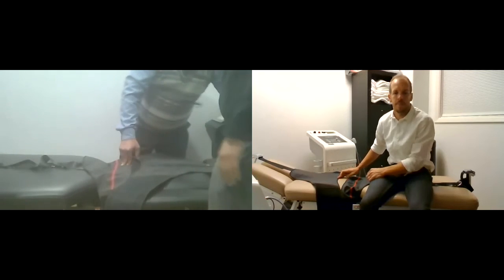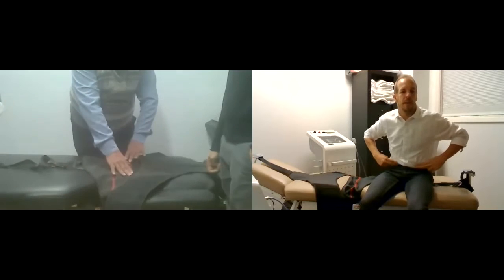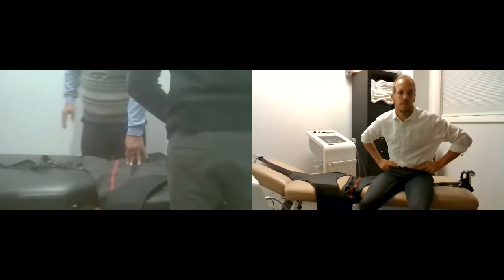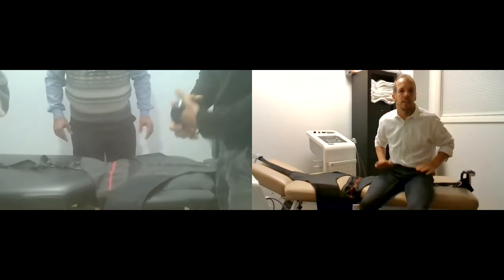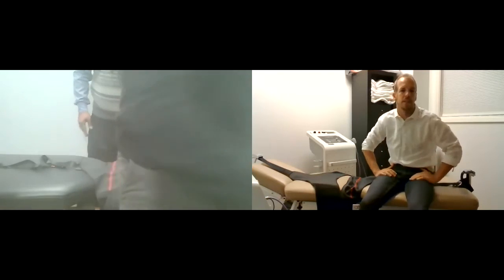Now what we want to do is, first of all, have him take off his belt if he's wearing a belt, and then have him take everything out of his pockets. So keys, wallets, cell phones, everything out of the front and back pockets.